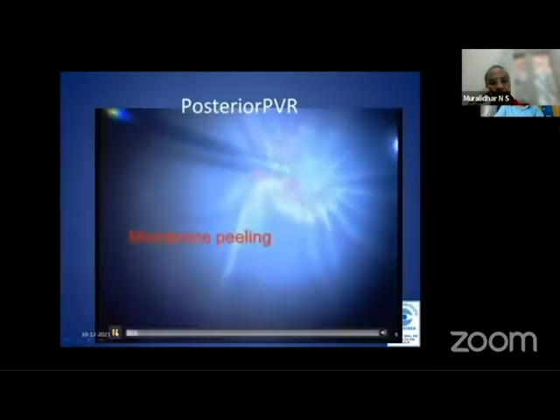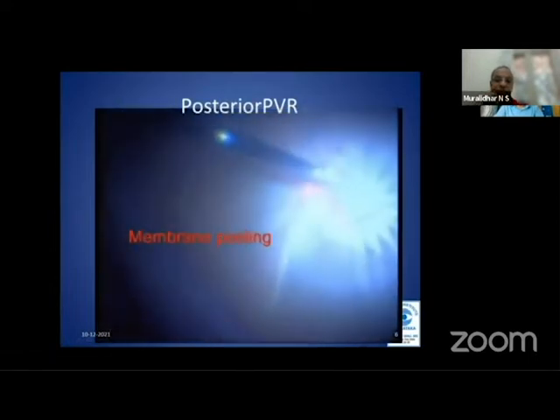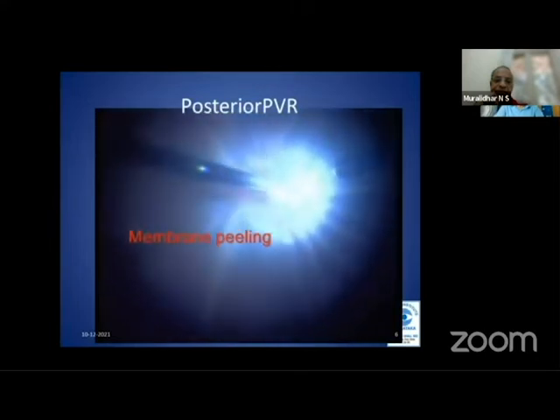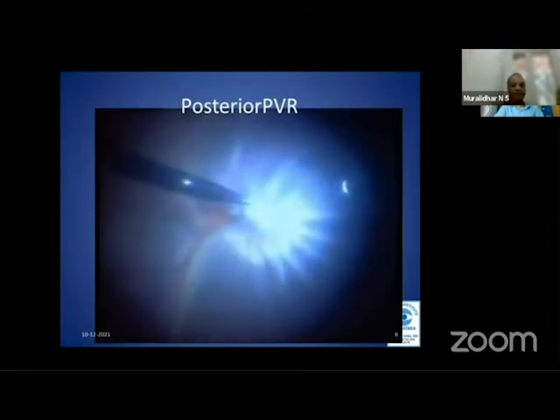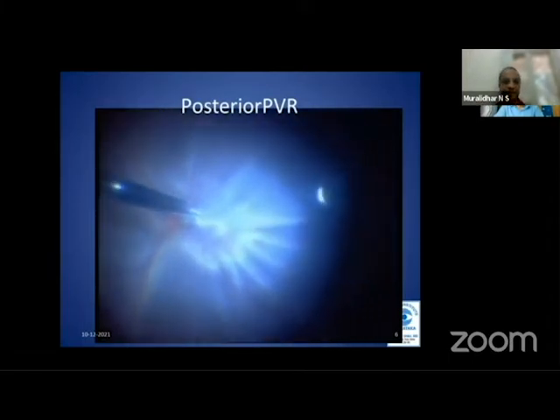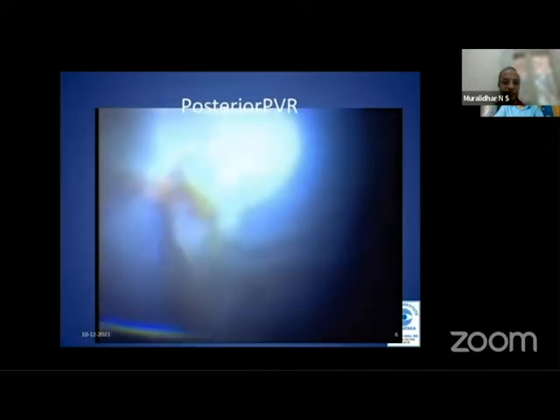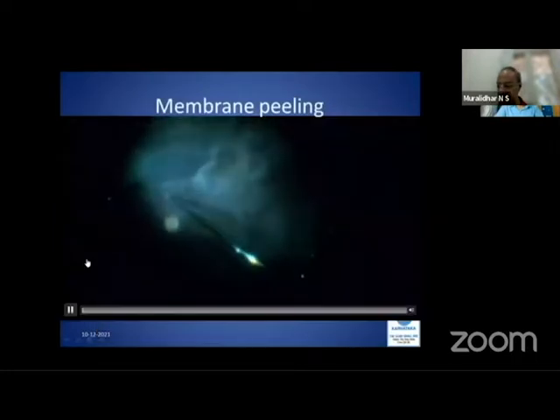This is a membrane which has caused a pucker and detachment in the posterior pole near the disc. We find the edge of the membrane and grasp it, and it comes off quite easily, separating from the retina. But it's important to remove the membrane by a posterior to anterior traction, and remove most of the anterior extension of the membrane as well. So this is a relatively easy membrane surgery.